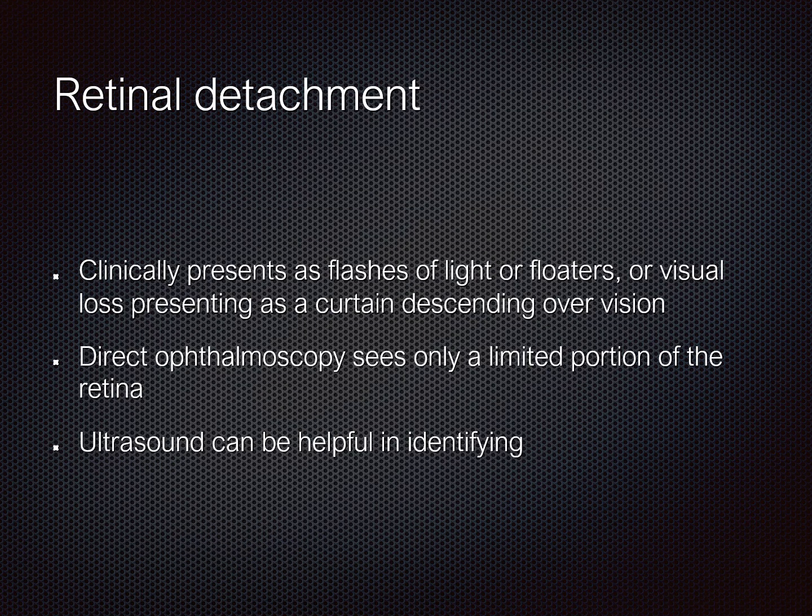All right, so let's start talking about some pathology. Retinal detachment is the first pathology that we're going to talk about. So retinal detachment is clinically suspected in patients with sudden onset flashes or floaters or vision loss that's like a curtain coming down over their field of vision. We often see it with trauma, also see it spontaneously, especially in people with connective tissue disorders. So a dilated fundoscopic exam is really how this diagnosis is traditionally made.